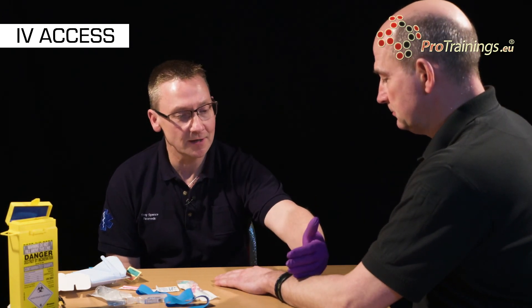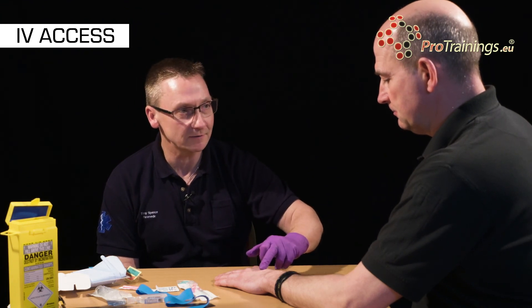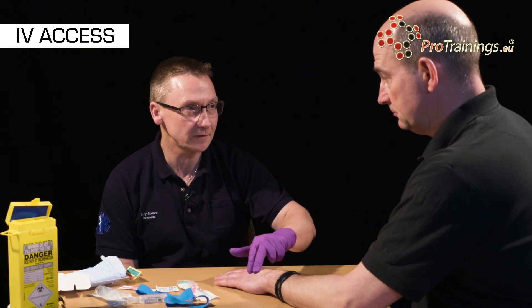Hi Duncan, my name's Tony, I'm a paramedic and we've agreed that we need to get some intravenous access so that we can give you some pain relief medicine. Do you understand that? The procedure will be: I will put a tourniquet around your arm and that will help me to see a vein on the back of your hand. I'll insert a needle in there and then just push a little bit of clear fluid through it to make sure that it's in place correctly. It will be a little bit uncomfortable.